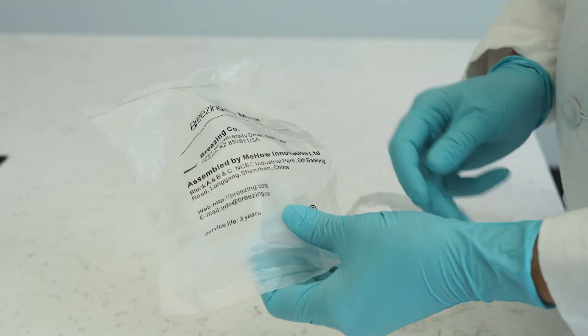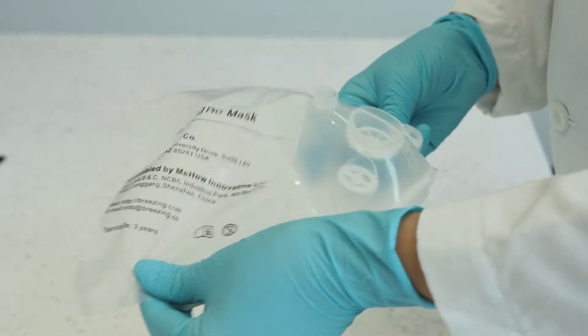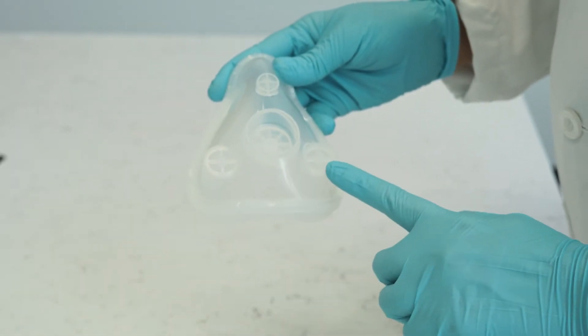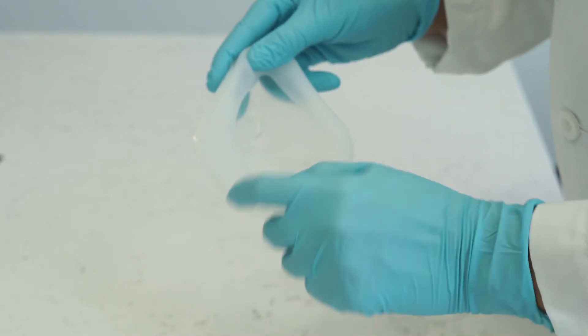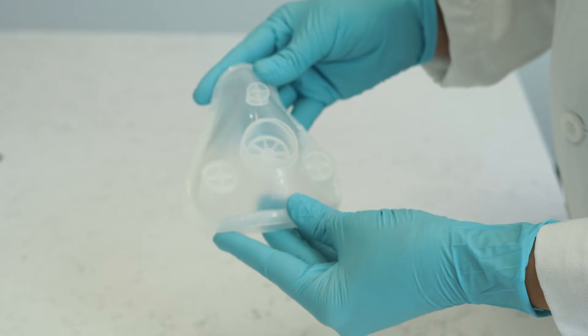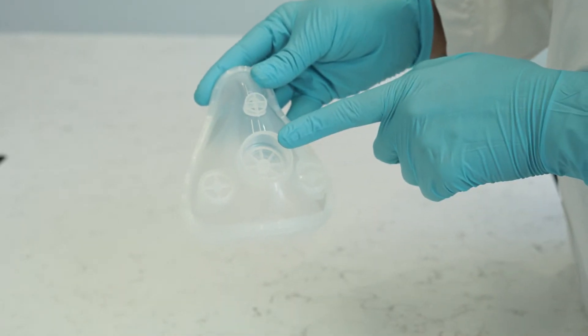The disposable mask is single-user use. It has two inhalation valves on the side, assuring the patient inhales fresh air in each breathing cycle and avoiding cross-contamination between patients. It also has one exhalation valve. Before use, check the integrity of these valves.